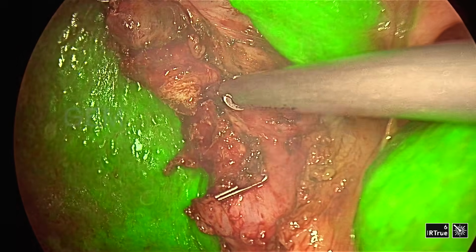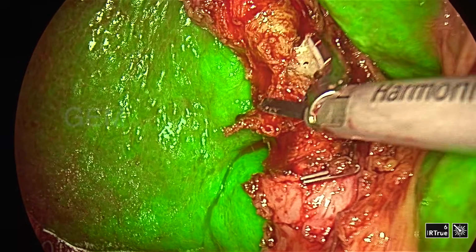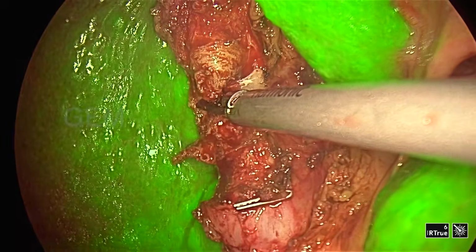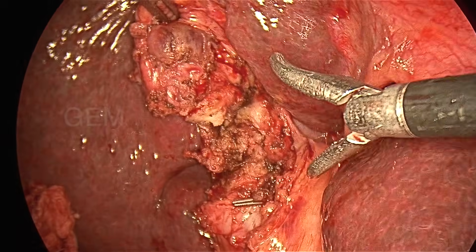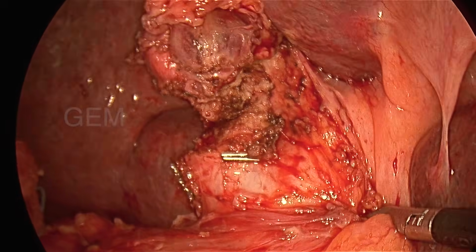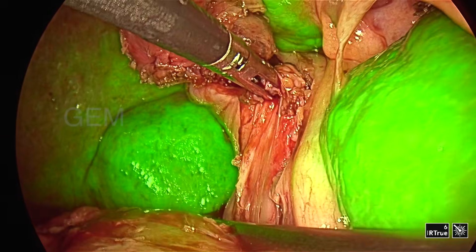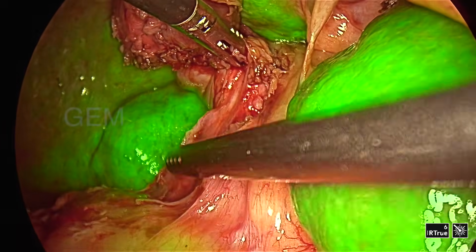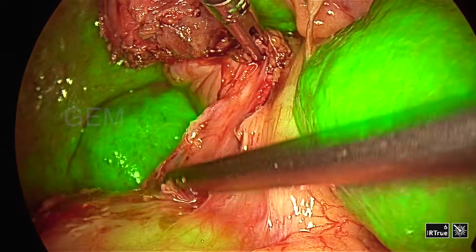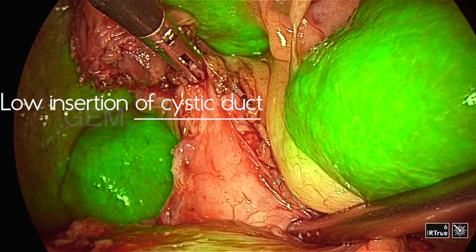You can see, since the Rouviere's sulcus is very low down, I could see it. I am just dividing this just above the sulcus level so that the right duct will not get injured. So now it is normal mode, and again you can see I changed to IR mode, and I have to go down and take down the stone. Now the entire duct is very thick, hard and thick, so it is a low insertion of the cystic duct.